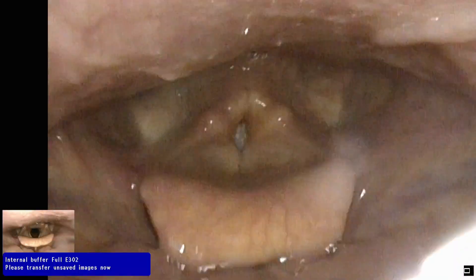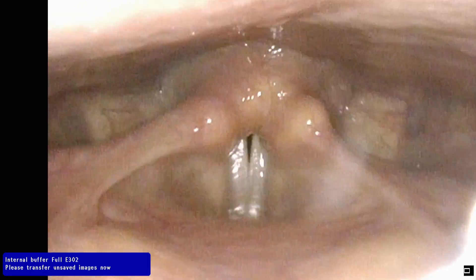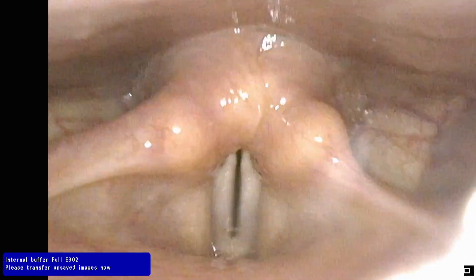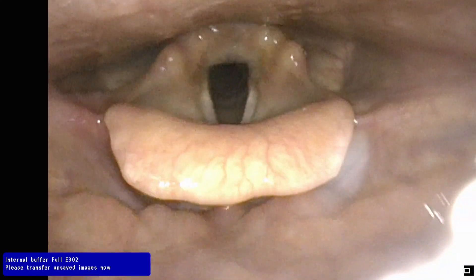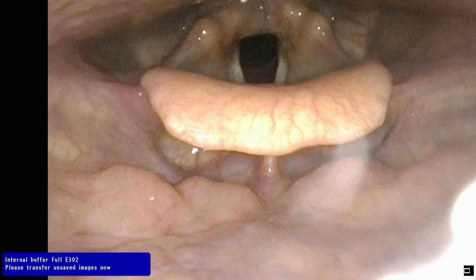Just a couple things and then I'll let you look, okay? Say E for as long as you can. Doing okay? Yeah. Okay, you're doing awesome. Thank you. Do that again.